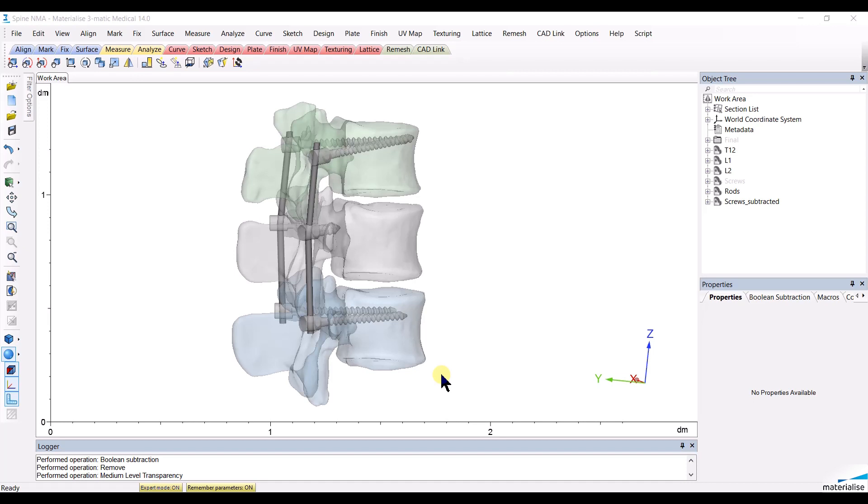Let's have a look at an example with three vertebrae, six screws and two rods. We will create an intersection-based non-manifold assembly, so it is very important that the structures are in fact intersecting with each other.